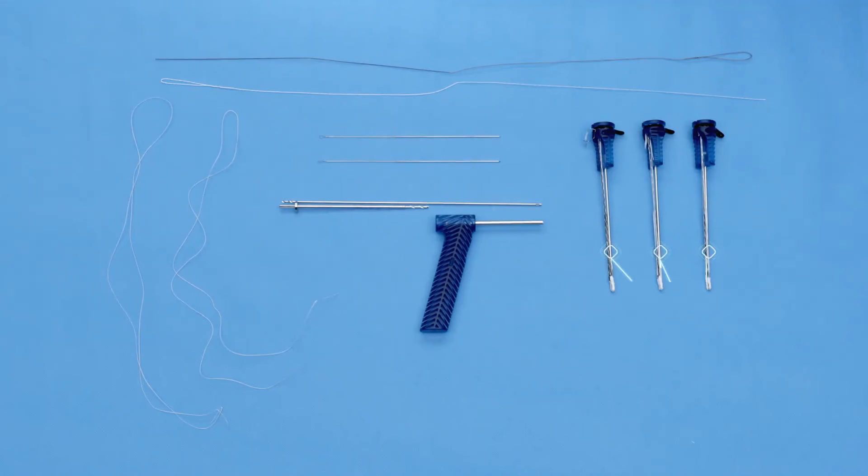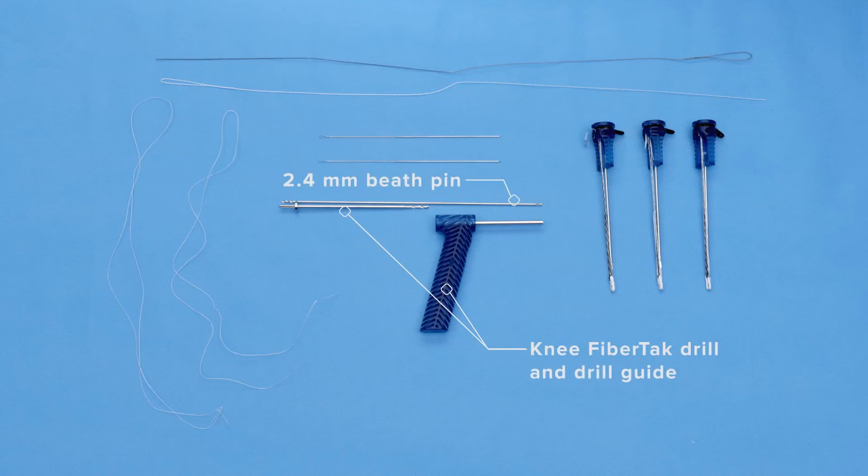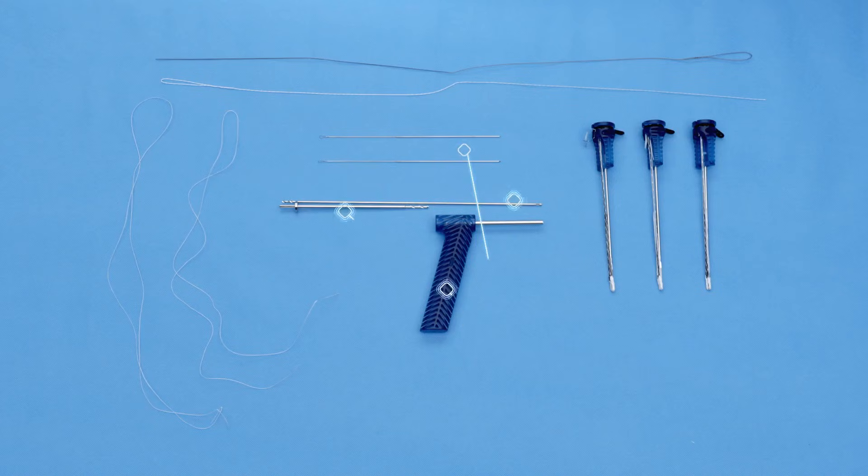On my back table, I have three double knotless knee fiber tack anchors. Two will be for the patella and one for the femur. Associated with that are the drill and drill guide for those anchors. There is also a 2.4 millimeter beath pin. There are two K-wires that are loaded with nitinol loops, in addition to two O fiber wire passing sutures for the transosseous pull-through of the anchors. And then finally, two number two fiber snares that will be utilized to assist with shuttling the graft through the knee.